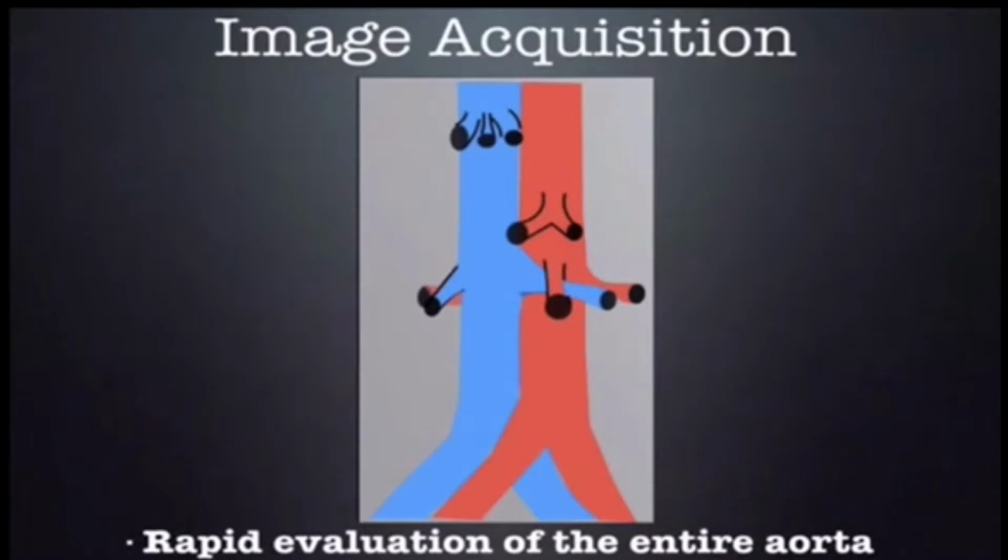abdominal aortic aneurysm, if you identify a AAA just above the bifurcation, then you have the diagnosis and you can move on rather than, again, spending a bunch of time at the proximal segment of the aorta looking for a AAA in a less common location while a patient is exsanguinating from a AAA in a more common location. So just do a whole sweep of the aorta to make sure there's nothing obvious. Then you can come back and do your exact measurements.